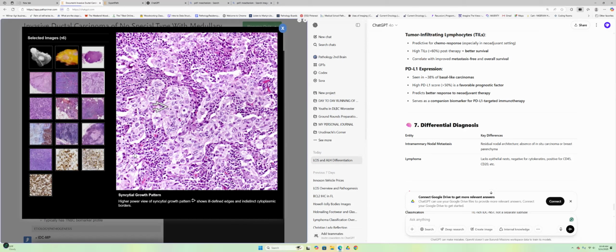Then depending on the kind of tumor, you start throwing in CD5, CD10. You want to look at whether you are dealing with follicular lymphoma. I will put B cell: am I dealing with CLL, mantle cell lymphoma, marginal zone lymphoma, all those things, CD23, CD21. It's a whole panel you're going to throw in there just to catch it. Actually, your histology pattern can guide you on the biology.